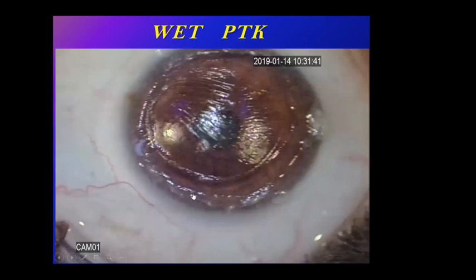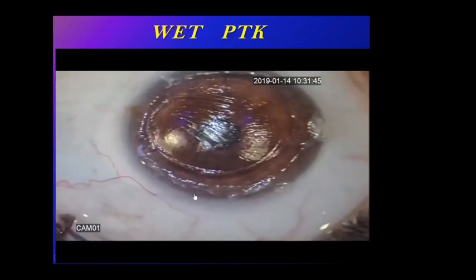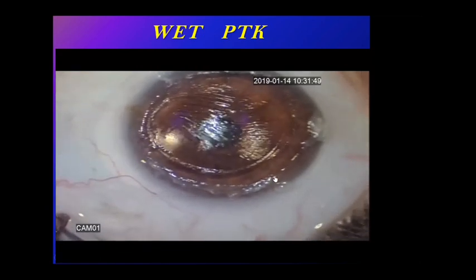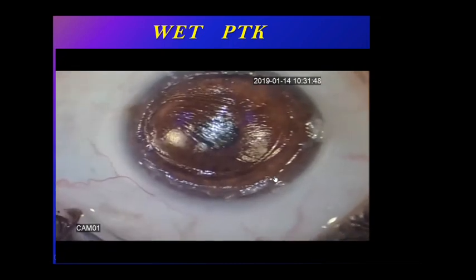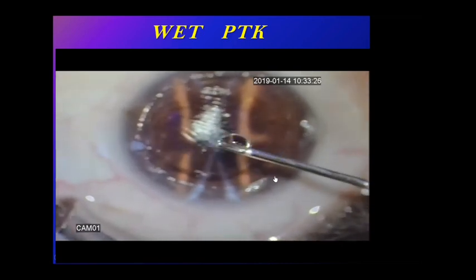So a lot of flaps, and now this is the one where we removed the epithelium. You remember we said epithelium, we may use it as a friend in the very big ones and in the sharp ones, but in the very thin ones we have to remove it to expose it. And then we don't use thick fluid. Here we use the thin fluid, the BSS. Look at it. It really looks ugly, isn't it? And the patient has a Maddox effect. All the lights have a Maddox effect. Now we put BSS here.